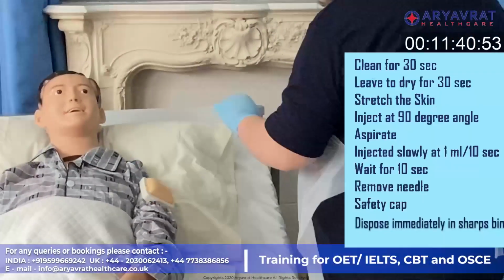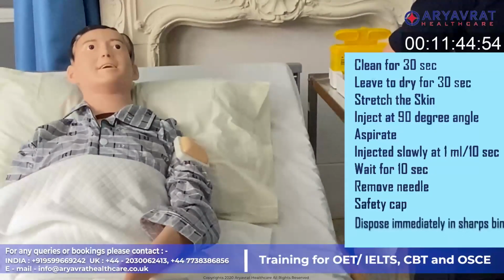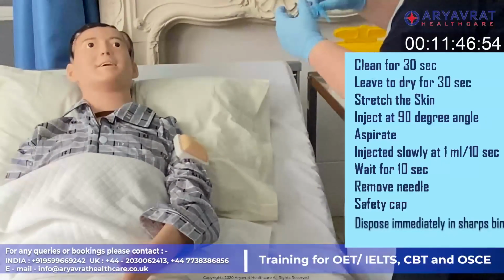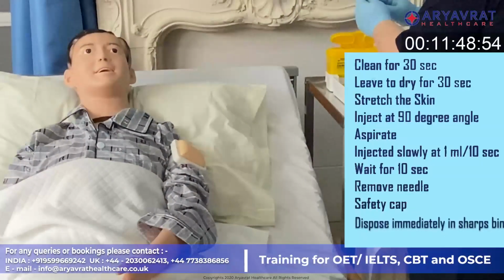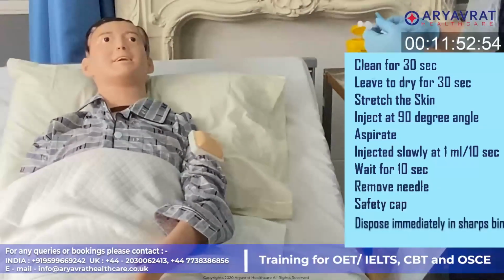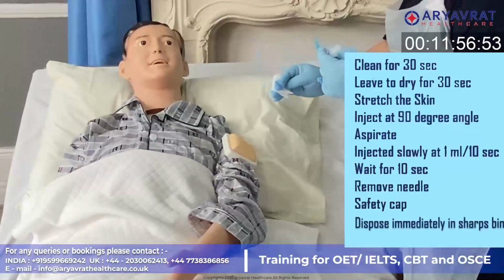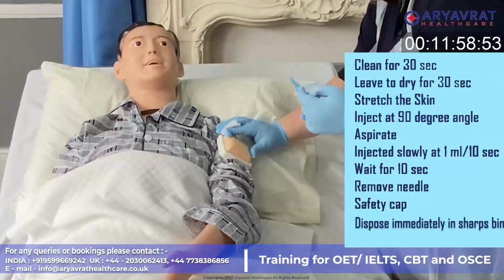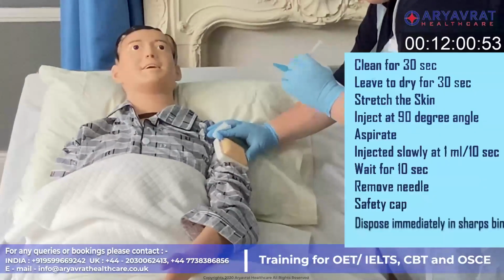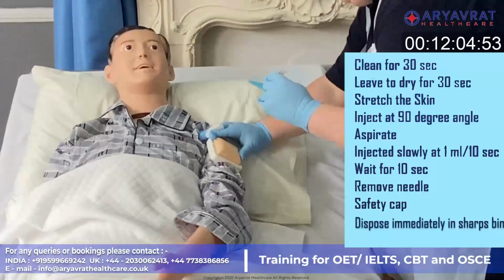So I am going to clean the top of your arm in a circular motion using an alcohol wipe. Okay. And then I am going to take your injection in my dominant hand. I'm left-handed, Fred, so I'm going to hold this in my left. So using my right hand, I am going to stretch your skin. Okay, so I am going to do the injection now, Fred.